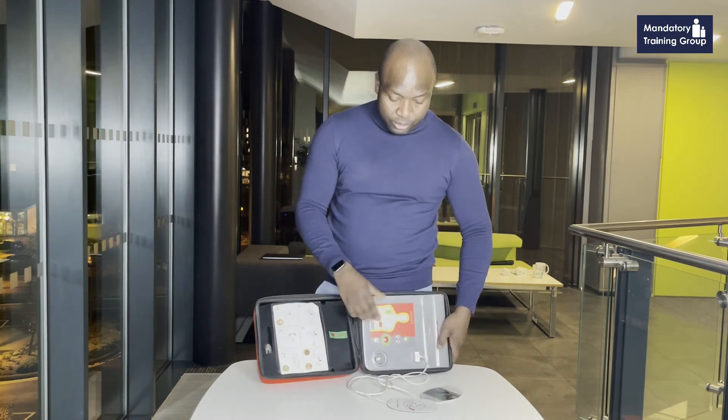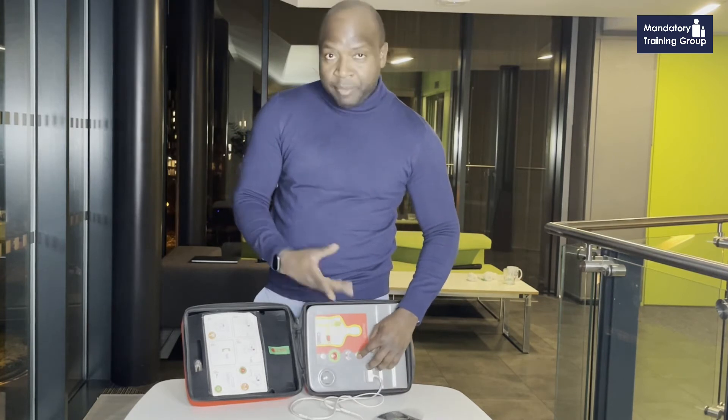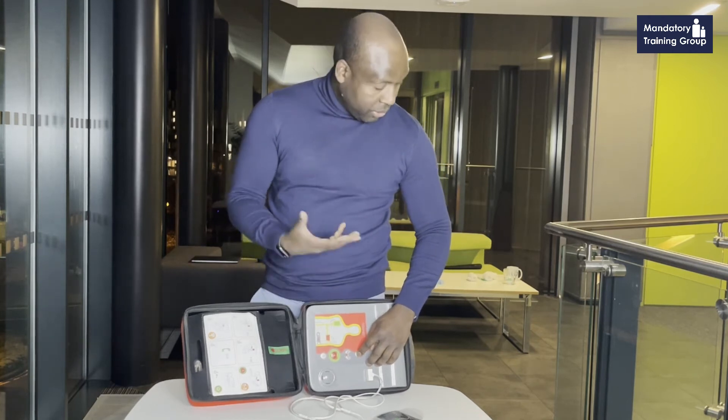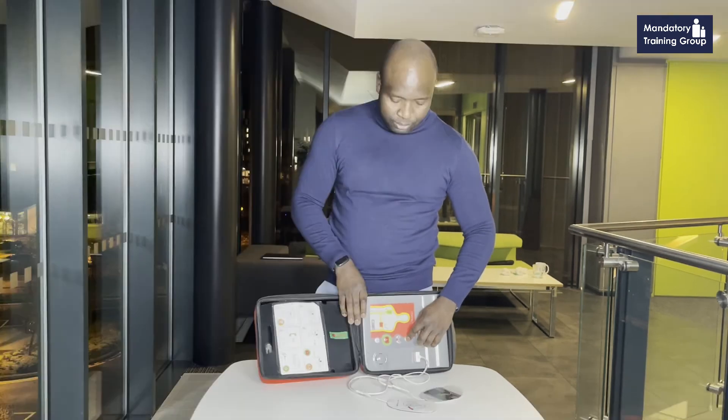The idea really is to put the pads on as quickly as possible. The moment you've placed the pads, the AED will recognize that and will start talking to you, giving you instructions on what you're supposed to be doing. If I press it, it will tell me exactly what to do.